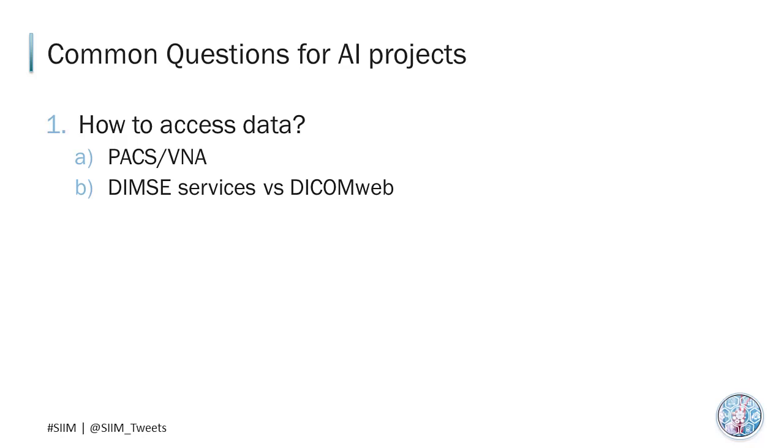You can get these objects via the traditional DICOM DIMSE services. I see that you are the cool internet generation. Then you'll definitely be interested in using DICOMweb, which is the next generation of DICOM that uses familiar web technologies like HTTP, JSON, XML, if your PACS or VNA support it. Okay, sounds like DICOMweb is where I want to go.